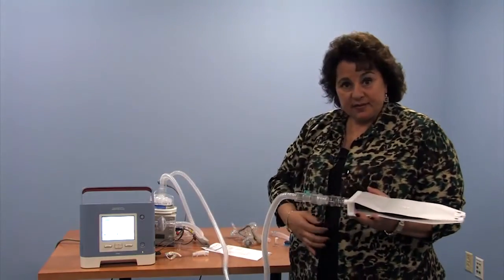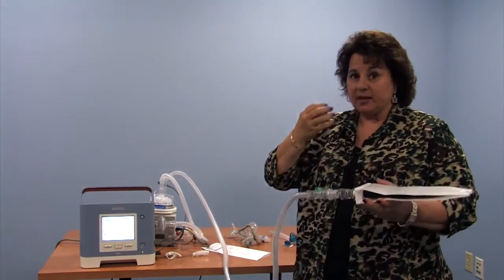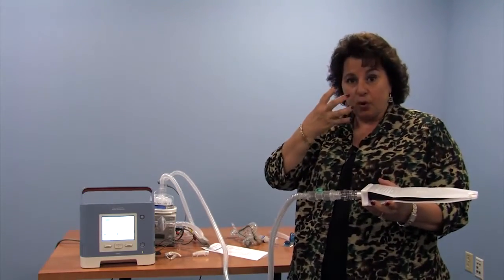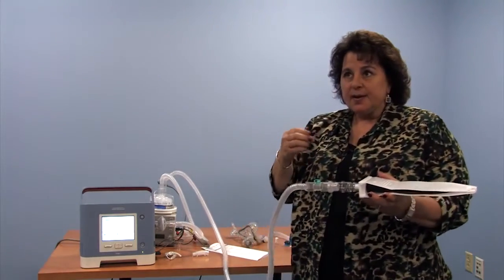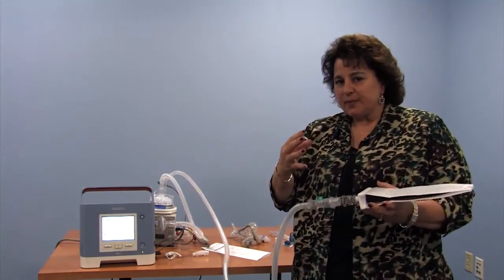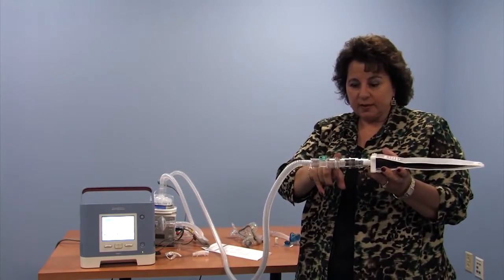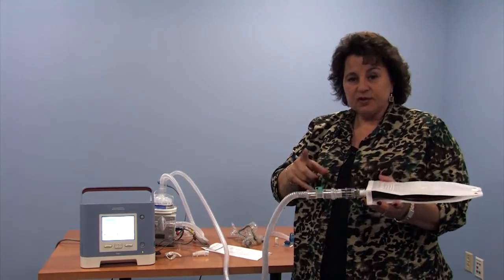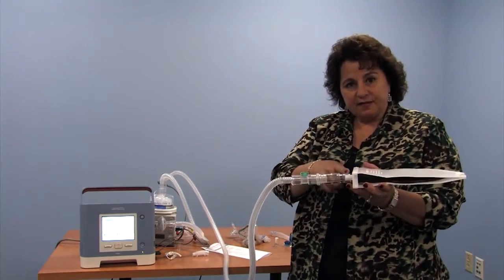The advantages to a passive circuit, one would be that your child was on a BiPAP mode to a face mask, either full face or nasal mask. You would use a solid hose directly to the mask, and the venting should be through the holes that are made and available in the mask itself. Some of our folks like certain types of masks that may not be vented, in which case you do have to keep the exhale port here on the machine. We need one exhale port, either in the mask built in or in the tubing. So for a tracheostomy patient, it's in the tubing. And like I said, we need a few adapters to get it to fit the tracheostomy tube.